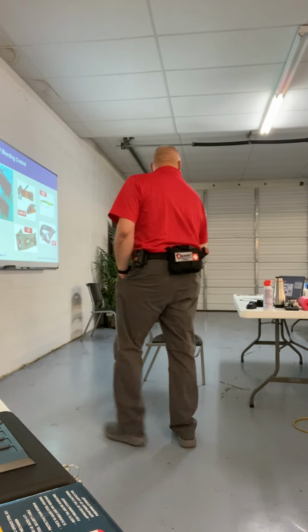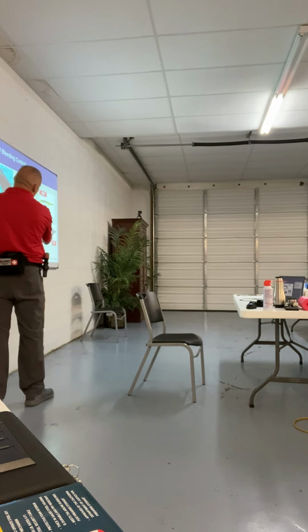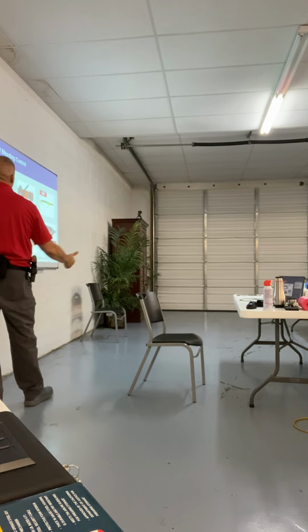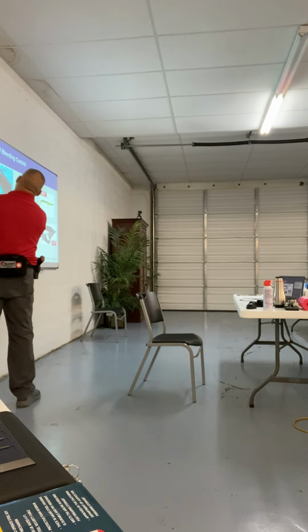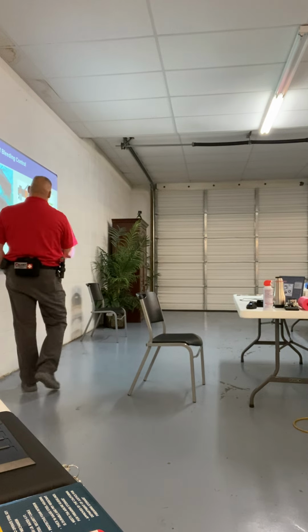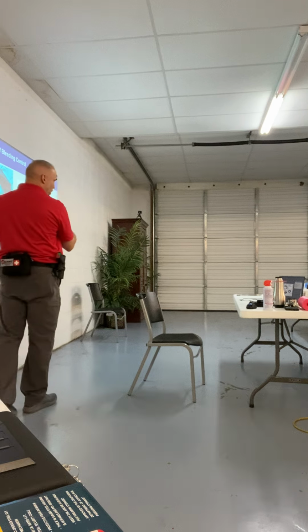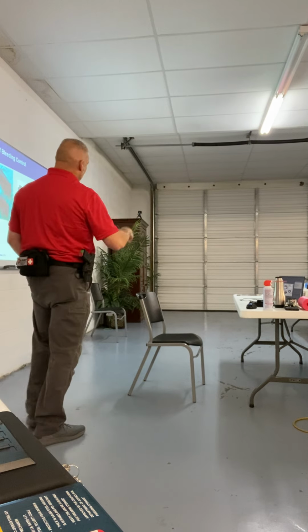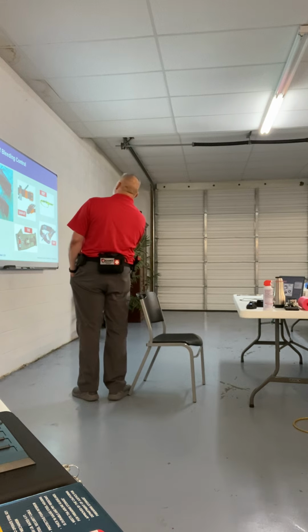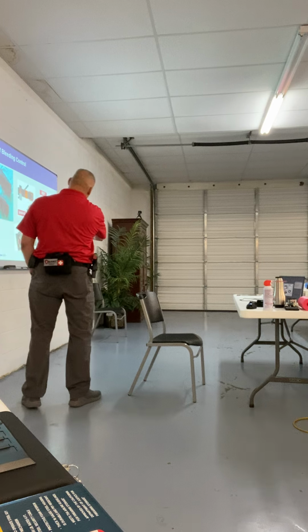So, tourniquets, these are all approved by TCCC, right? These are ones you may find in the community, with the EMS, with the fire department. The majority of them you'll see are going to be your CAT-T and your SOFT-T. I don't like the RMT just because of the width of it. I think it's good for a kid because it's about an inch and it doesn't give you enough compression. The rest of these are some variation of the CAT, but a little more difficult to use.